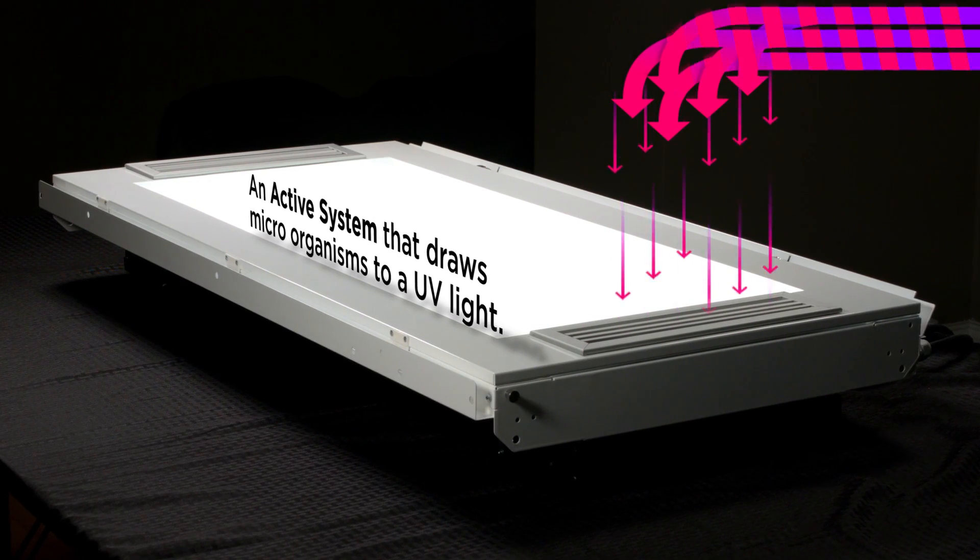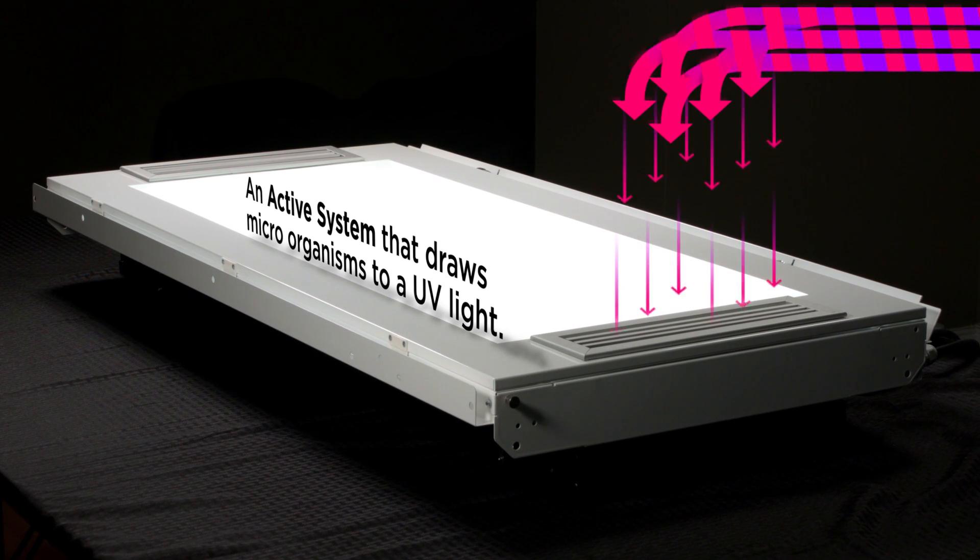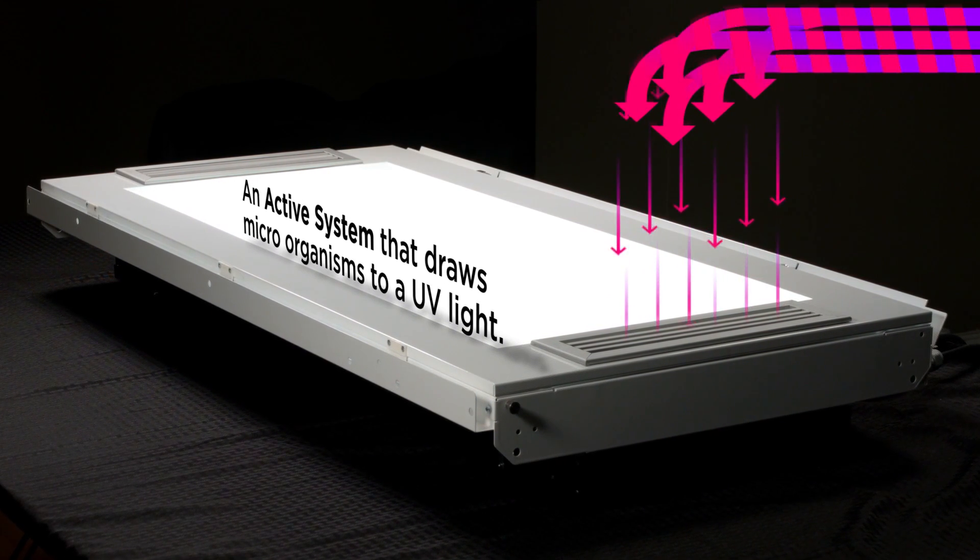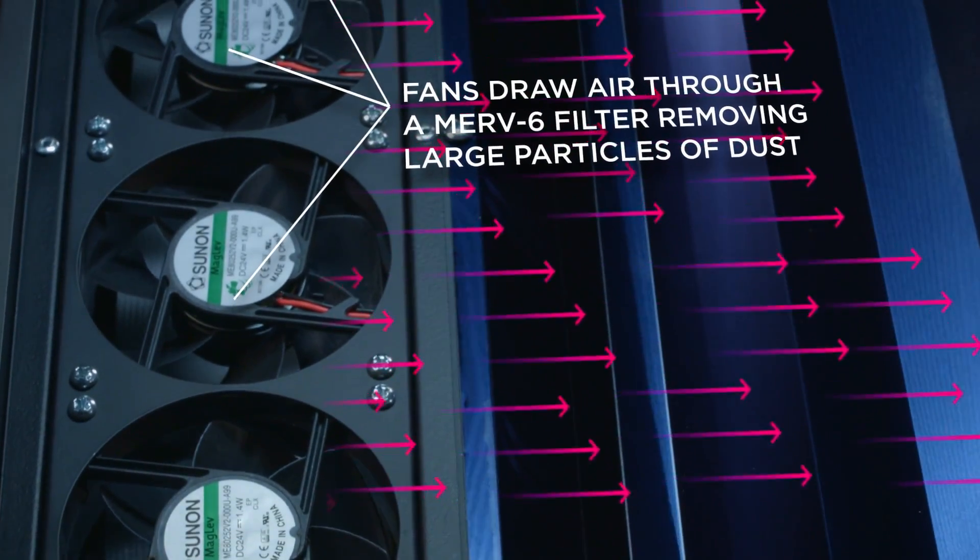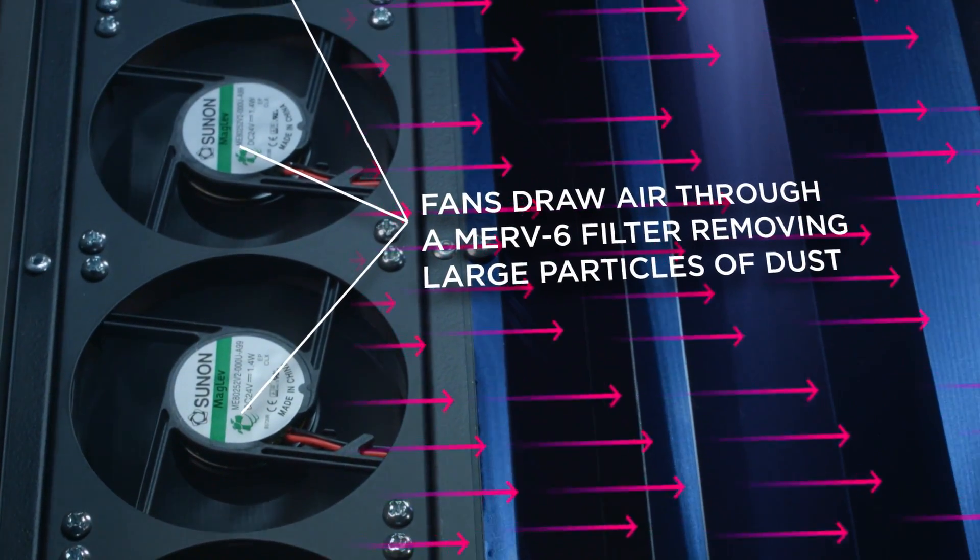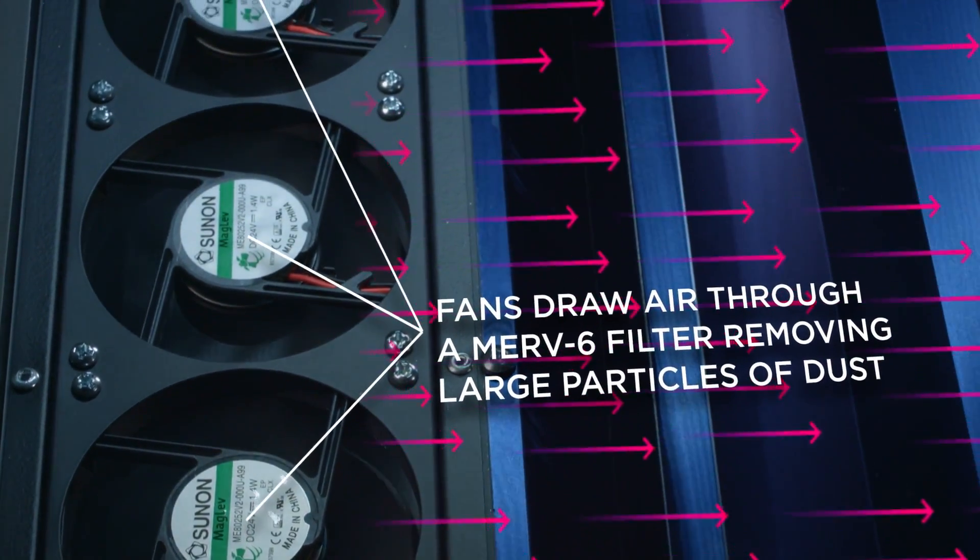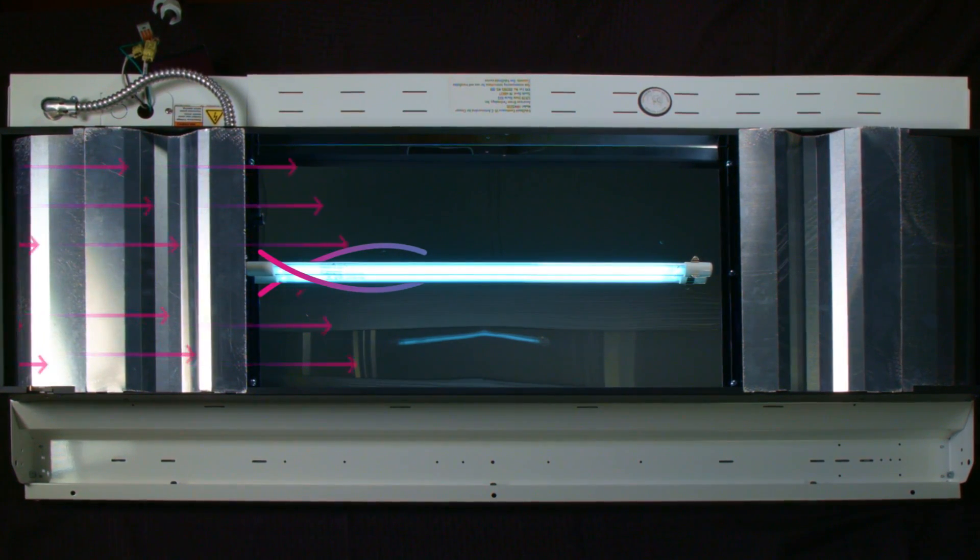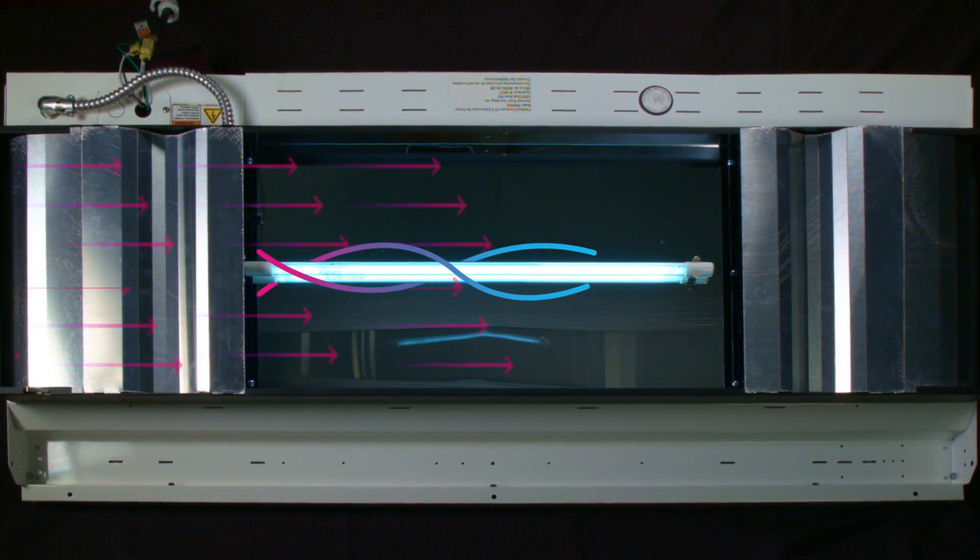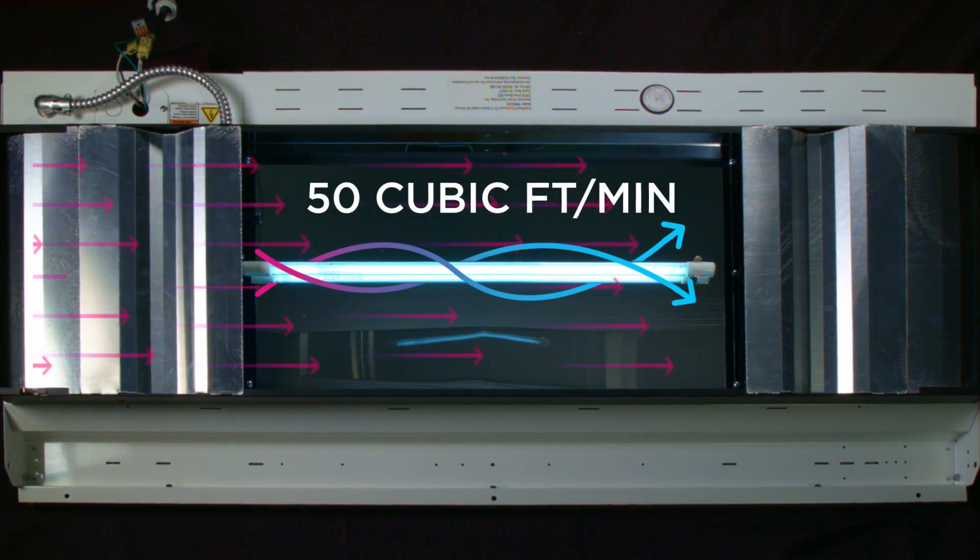The patented VitaShield is an active system that draws microorganisms to a UV light. There are two vents on the face of the fixture. Behind one is an array of fans which draws air through a MERV-6 filter which removes larger particulates of dust. Air is pulled through the filter into the UV chamber mounted on the back of the fixture at approximately 50 cubic feet per minute.